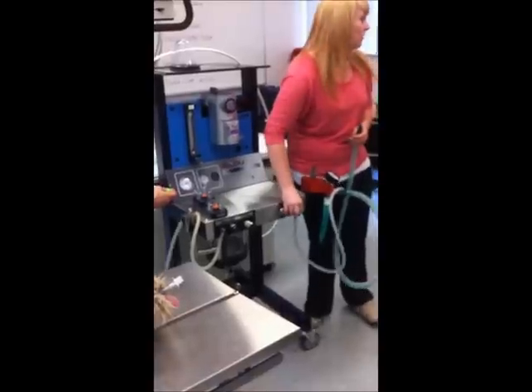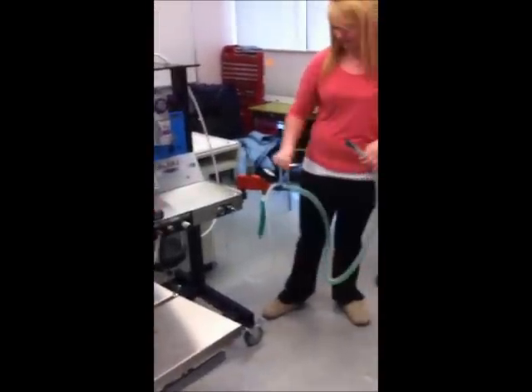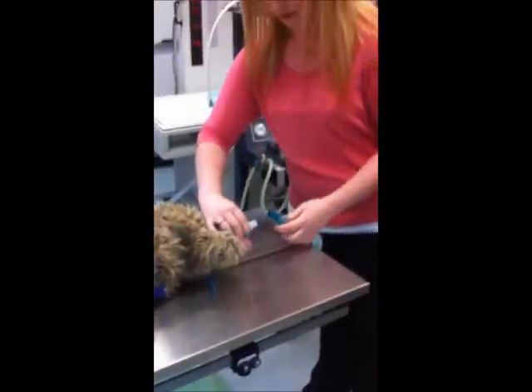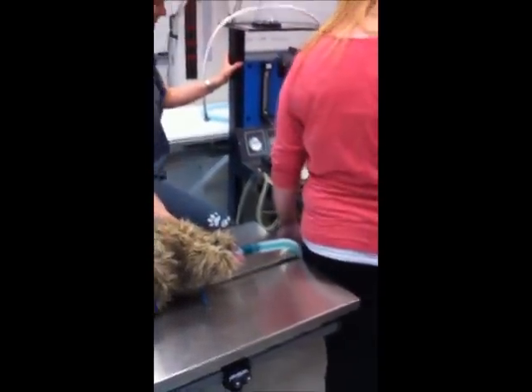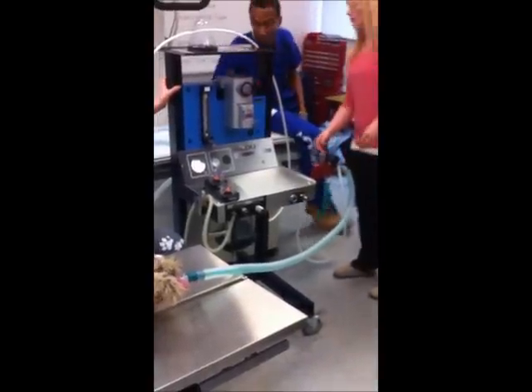How am I supposed to take notes? See? That's why I should take my own notes. I'm gonna fail because of you. It's all your fault. So now it connects to the dog. Where's this? Where did it go? Okay, that doesn't fit on there. Happens every time. Missing anything? Scavenger. Check, yeah. Go back.